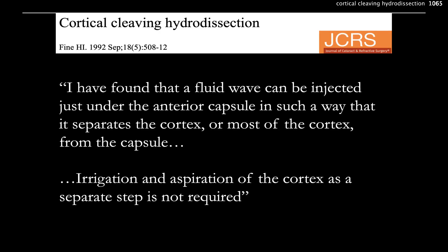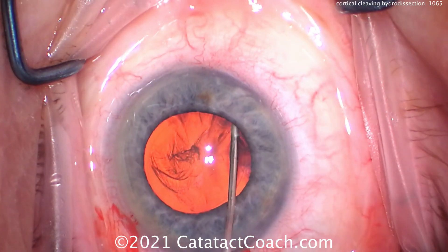Howard Fine says in this paper: 'I have found that a fluid wave can be injected just under the anterior capsule in such a way that it separates the cortex, or most of the cortex, from the capsule. Irrigation aspiration of the cortex as a separate step is generally not required.' So let's watch that one more time.